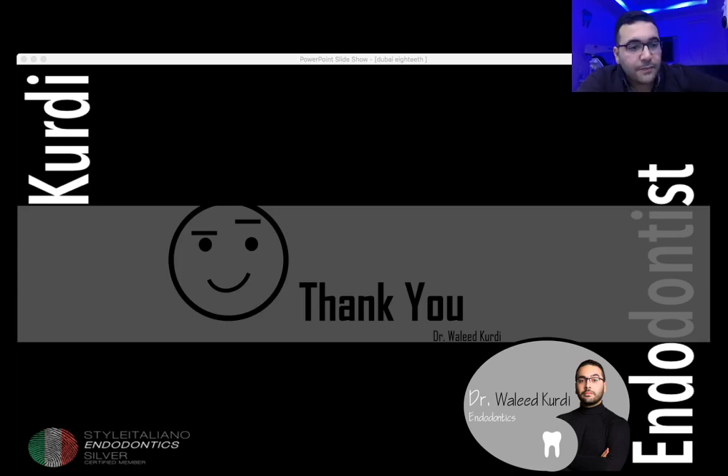Any other question? How not to overheat the ultrasonic tips? Dr. Stanislav. All right, you can use lower powers, but if you use lower powers, it will not remove the dentin in an appropriate way. So you can use irrigation, you can use intermittent steps, you can use the ultrasonic without coolant to enhance the vision, and then cool the whole system with irrigation and dry again.